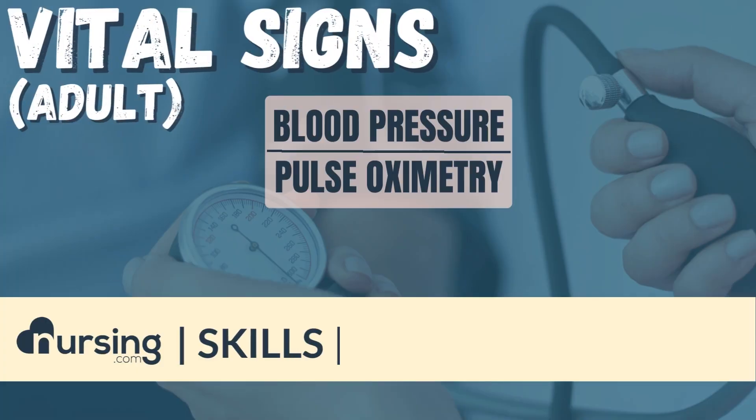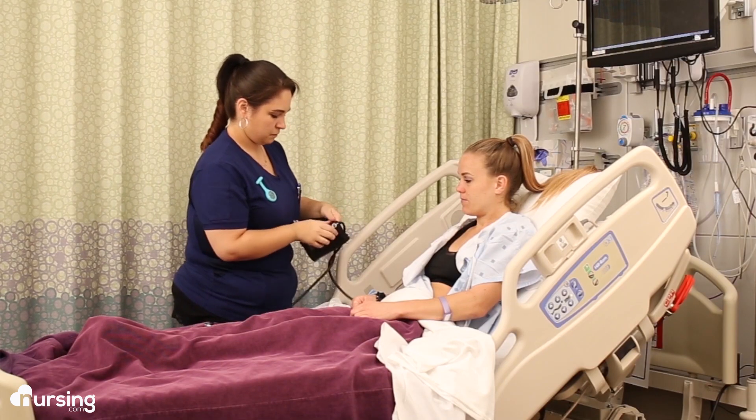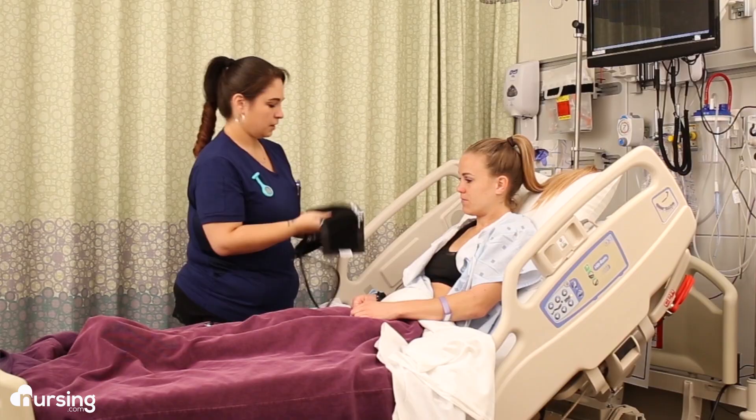The vital signs we're going to review are blood pressure and SpO2, or pulse oximetry. Getting a blood pressure isn't always as easy as just slapping on a cuff and hitting start on an automated machine — sometimes we have to take it manually.